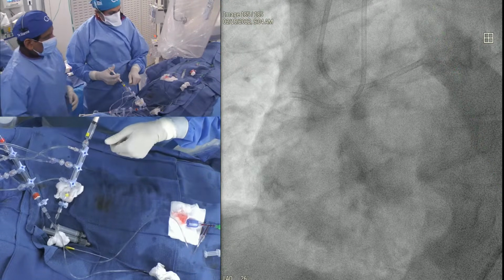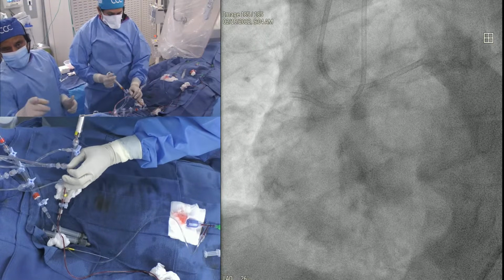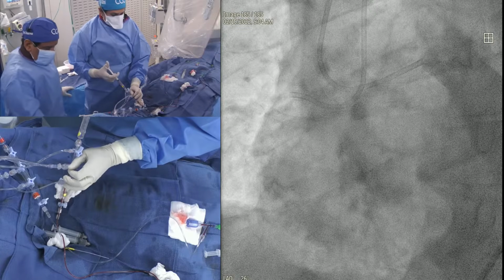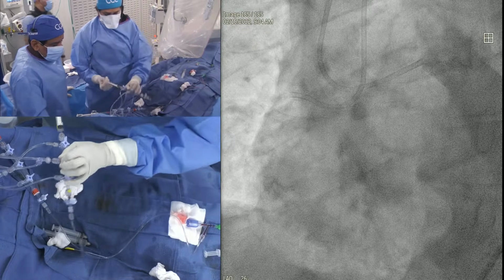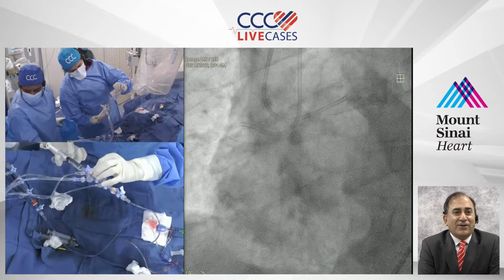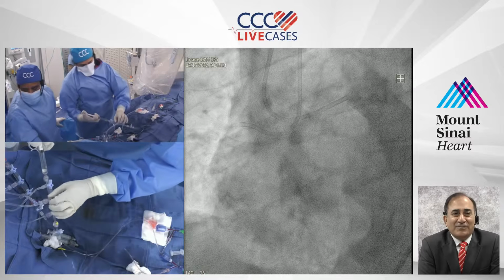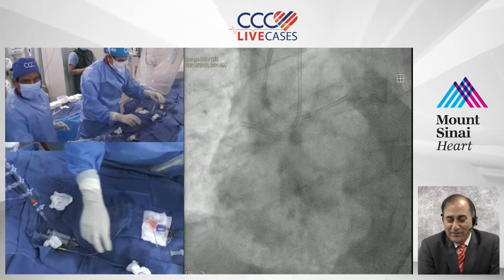Look, invaluable teaching case. You'll find it fascinating. Dr. Sohail Rashid says it's good seeing you watch a torquing device. Side now Fielder XT, right? Everybody felt that your fingers were doing all the work.